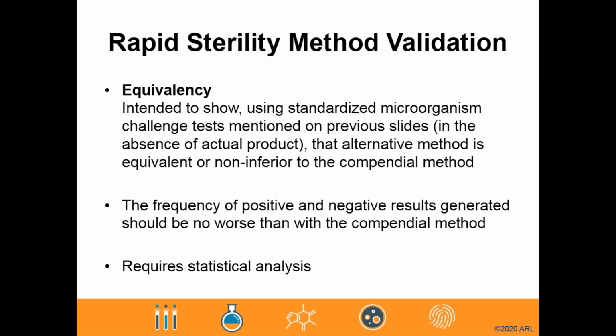Ultimately, the aim of validation testing is to demonstrate the acceptability of the alternate procedure relative to the current microbiological practice. To do that, the laboratory must demonstrate that the new procedure is as good as or better than the current procedure in terms of the ability to detect the presence of microorganisms. This is considered equivalence. USP states that alternate methods may be used if they provide advantages in terms of accuracy, sensitivity, precision, selectivity, or adaptability to automation. It also says that they must be shown to produce equivalent or better results than the referee method or the compendial method for any given quality attribute.